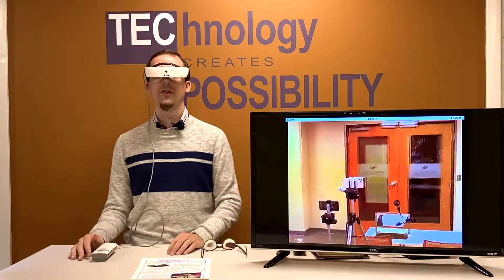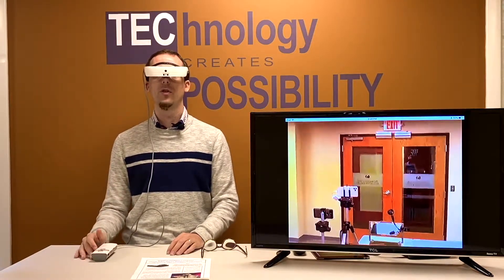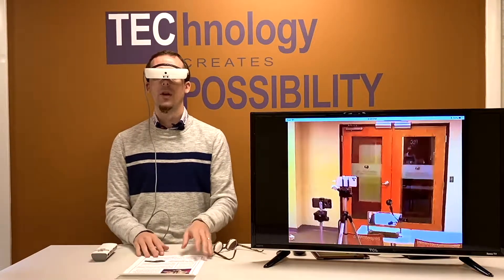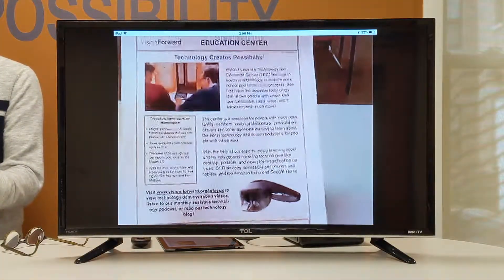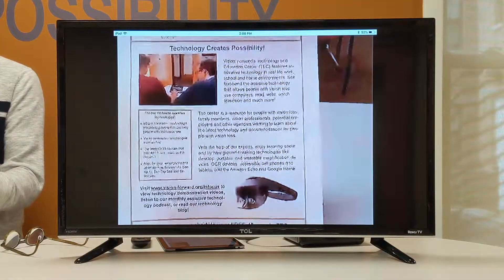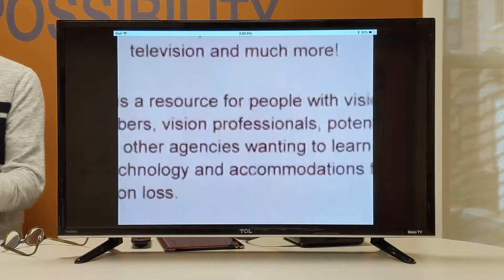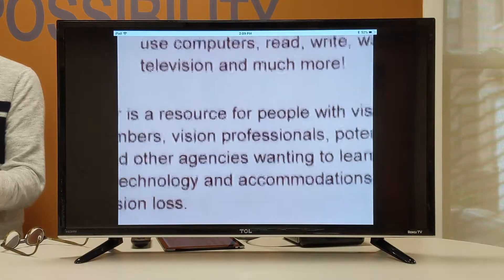We were looking into the distance with the eSight, but it can also focus up close, so we can use it for tasks such as reading. I'm going to go ahead and hold up this document in front of me. At the moment it's quite small so let's zoom in on it to make it a little bit larger — five times, two times, four times. Now that's looking pretty good but I want a bit more contrast.